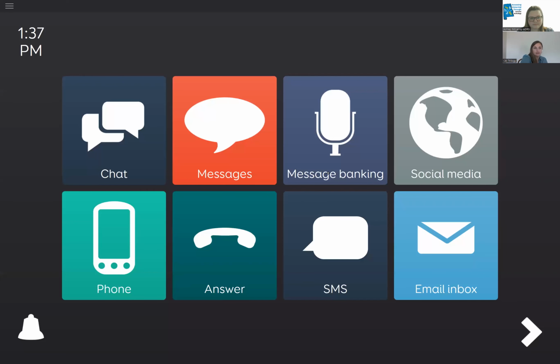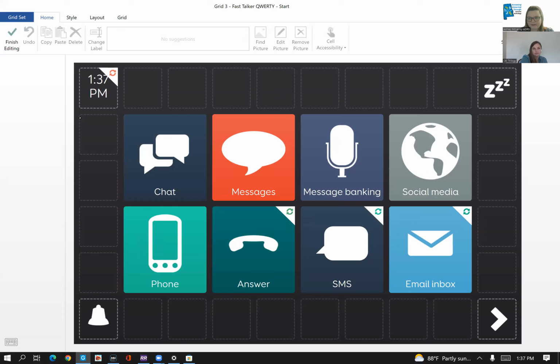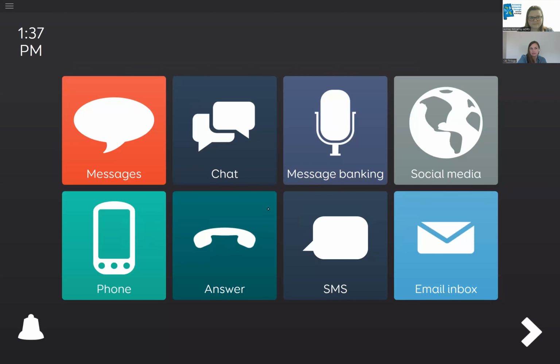So we'll go here. And if you didn't see what she just did, she clicked on the menu icon at the top and selected arrange grid. And then it allowed her to move stuff around, and then she had to go back up there and say finish arranging. Yeah, and so now I'm within a grid set, and if I wanted to arrange it in some sort of way, I went back to that 3-line menu and edit grid this time. And then you can click, hold and drag and do all kinds of edits, and then finish editing to save the changes, and all of those changes will be made there.